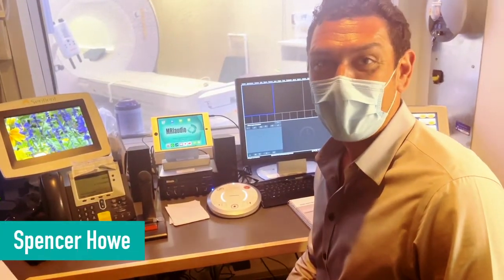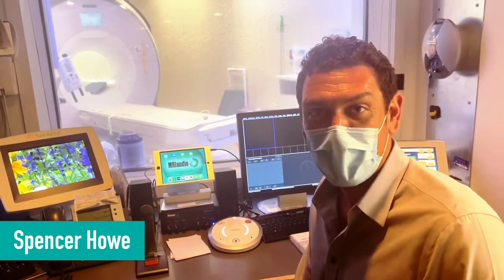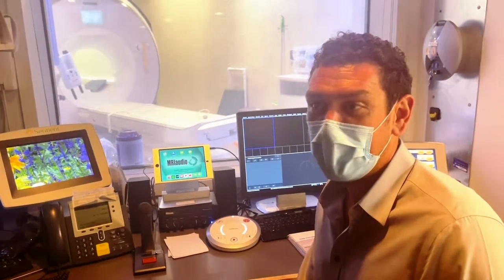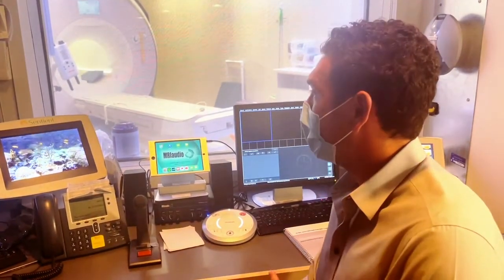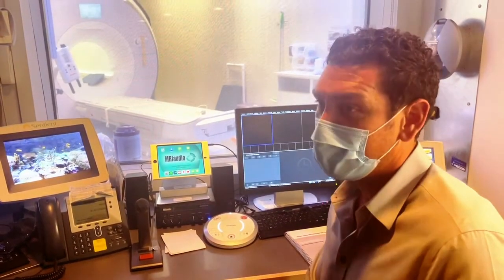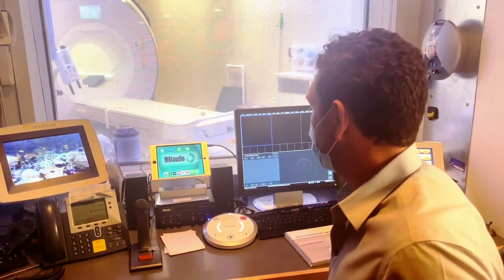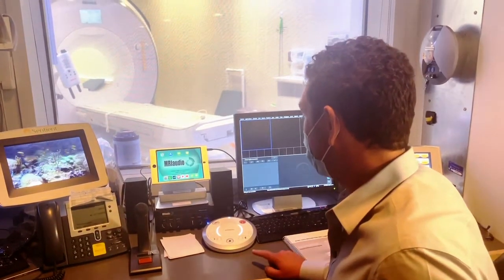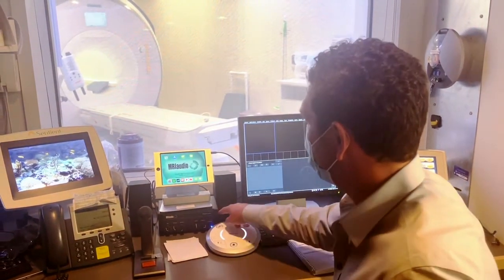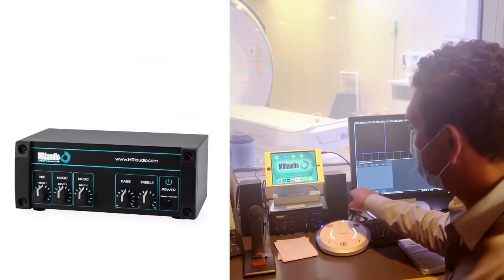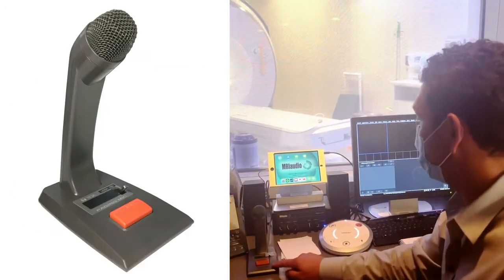Hi, my name is Spencer Howe. I'm at Massachusetts General Hospital in the Yawkey Building. MRs 1 and 2 have a complete MRI audio system that includes a digital amplifier, technologist speakers, and a technologist microphone.